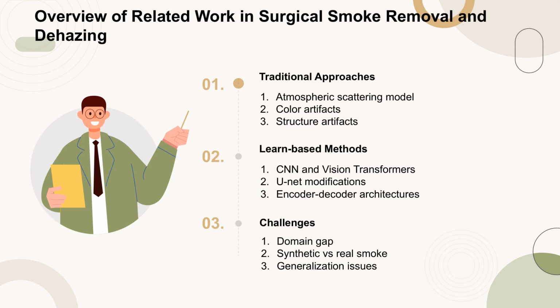Traditional approaches to surgical smoke removal have relied on the atmospheric scattering model, which often results in color and structural artifacts. More recent learning-based methods have utilized convolutional neural networks, CNN, and vision transformers, with notable examples including modifications to the UNet architecture and encoder-decoder structures. Despite these advancements, a significant challenge remains: the domain gap between synthetic smoke simulations used for training and real-world surgical smoke, leading to issues with generalization to actual surgical scenes.